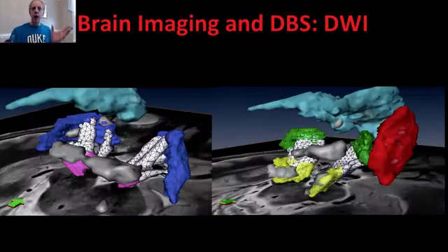You can, of course, add the diffusion-weighted imaging that we saw earlier in this video. This is represented here with gray. These are the fibers that we computed. So the neurosurgeon can start thinking, okay, if I touch this region because it's connected to this, then when I put electric pulses there because I inserted my electrode there, that will also affect this region because they're actually connected.